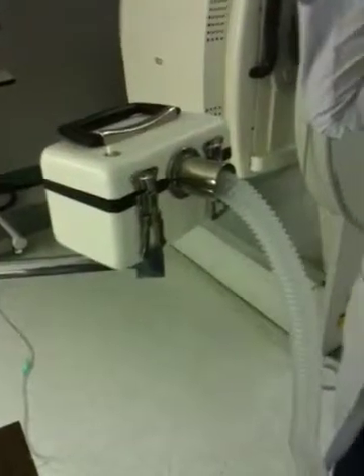Once you know you have a good vent, this is how you dispose of it. Get one of these containers. Take it out, dump it in here, wrap them up with the metal thing, put a sticker label on it — label it before you do everything. Once you're ready, wrap it up, tap it on there, and throw it in here. That's lead shielded. I measured it already — it's a really bad one.